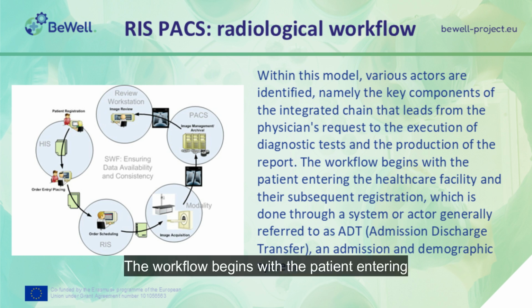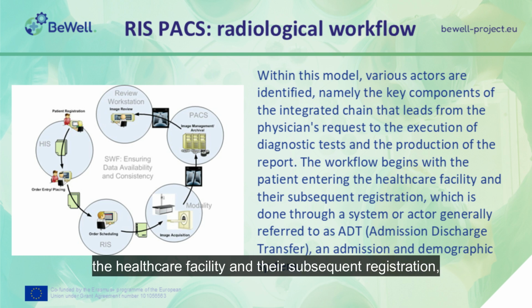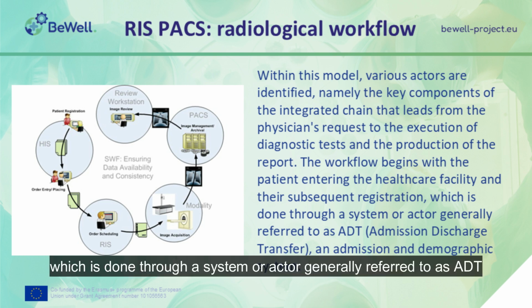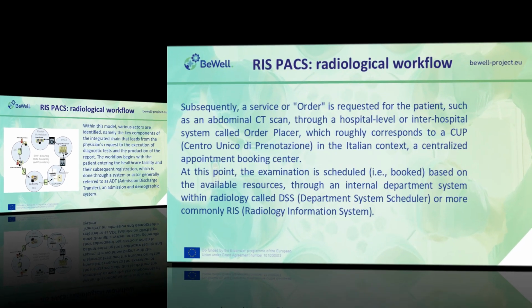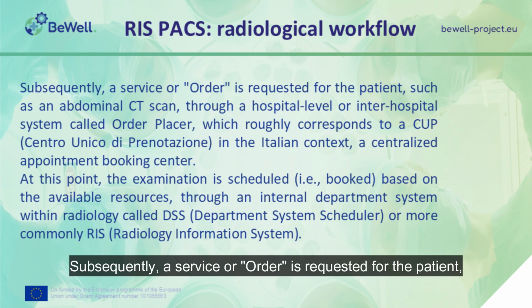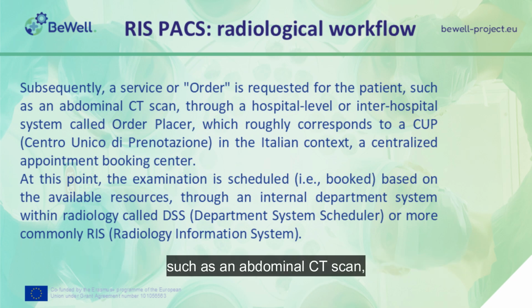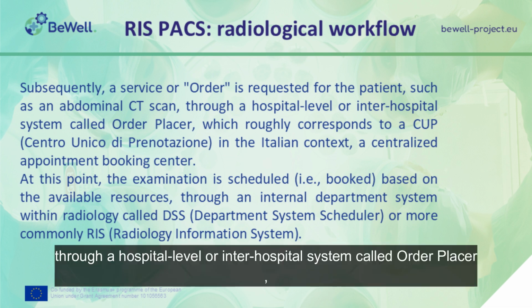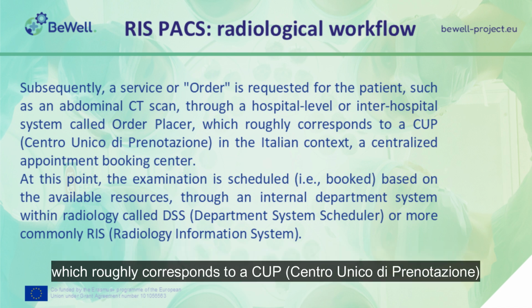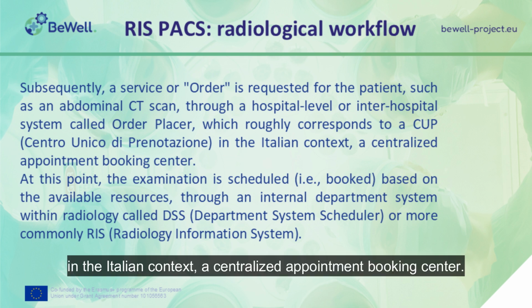The workflow begins with the patient entering the healthcare facility and their subsequent registration, which is done through a system or actor generally referred to as ADT, Admission Discharge Transfer, an admission and demographic system. Subsequently, a service or order is requested for the patient, such as an abdominal CT scan, through a hospital-level or inter-hospital system called Order Placer, which roughly corresponds to a CUP, Centro Unico di Prenotazione. In the Italian context, a centralized appointment booking center.